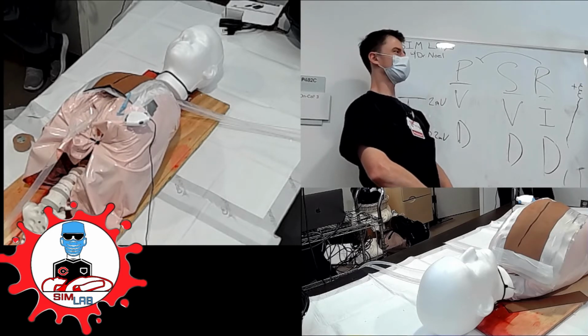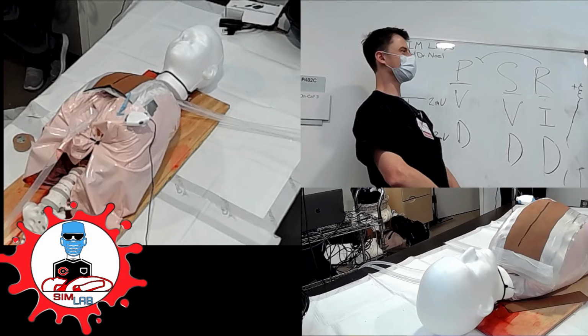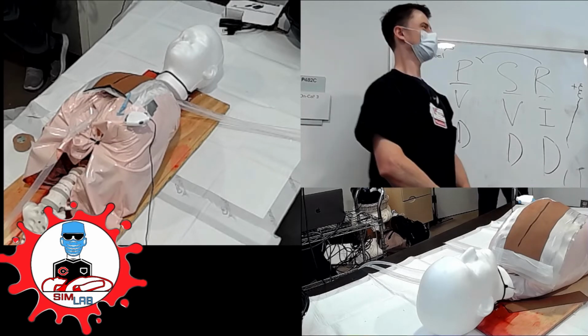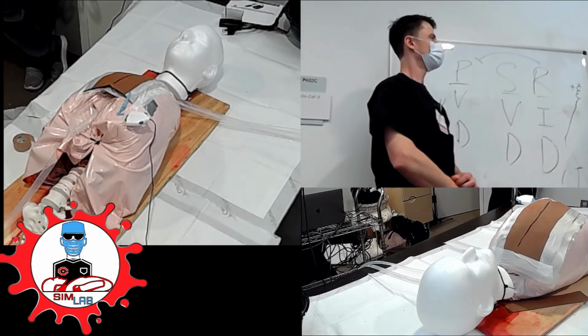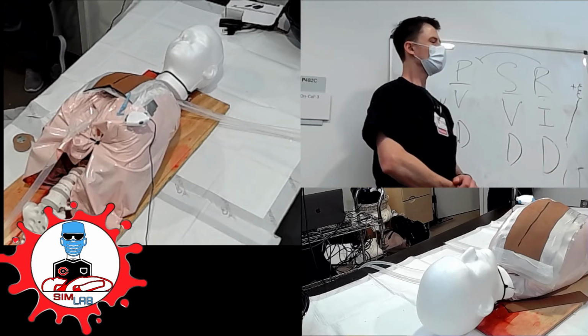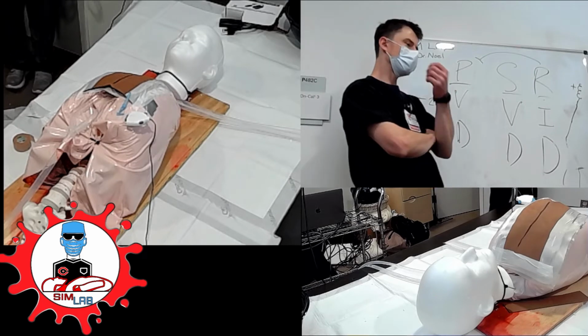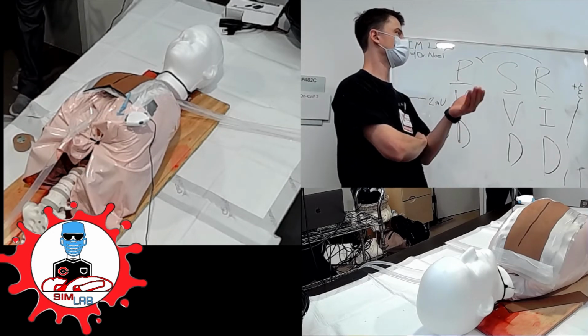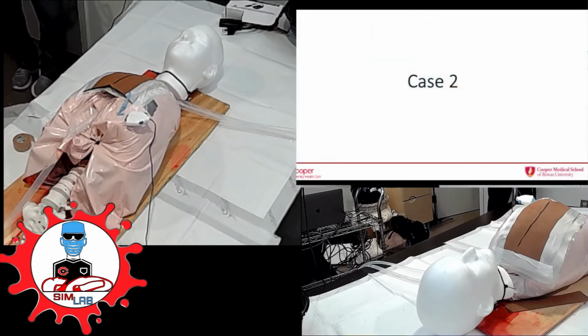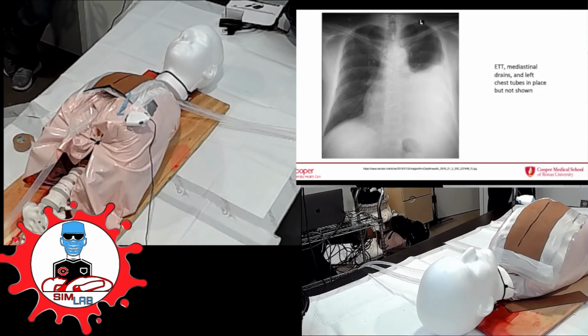Beyond that, I would be like, all right, it's not fixing the problem. Same line of question: tidal volume, how high are we talking? Well, you probably notice, if you've been on Blue yet, they come out usually on higher tidal volumes than most of our patients would be on. A lot of them come out on maybe 550. I've gone up to 600, 650. Beyond that, again, what are we achieving here?